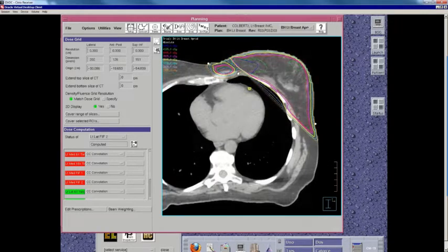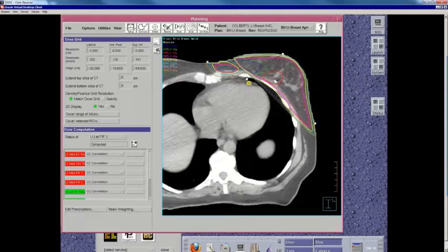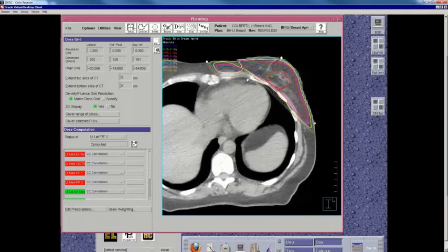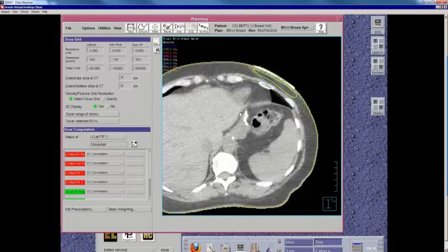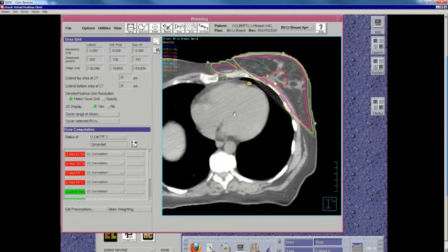You can see there's a little bit of a cold triangle here, where the 90% isodose line is not bridging this area, and instead we're bound by about the 70% isodose line here in purple, or 75%, I can't remember which, whatever 2804 out of 4005 is, I think that's 75%. But in any event, what we typically shoot for is that this purple isodose line doesn't break up where the fields match. And that's a reasonable rule of thumb that we've used for years and seems to keep us out of trouble. So this is a very reasonable and acceptable plan, and this is indeed how this patient was treated.